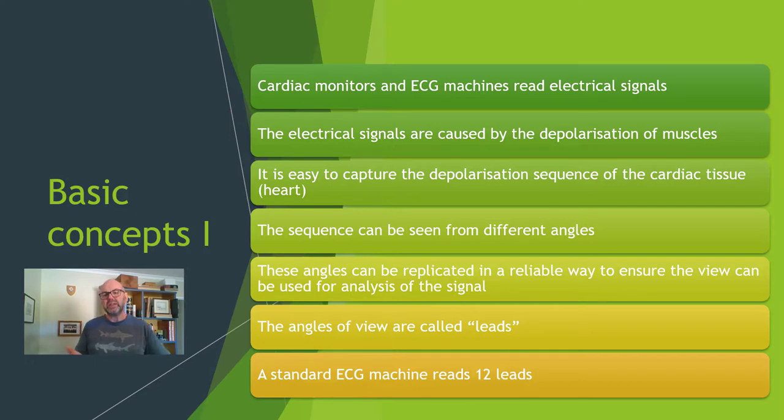You might want to liken this to photographing a car from various angles to sell it on Trade Me or something. The front might appear different from the back of the car, but if it's a good day, it'll still be the same car. Careful placement of the electrodes will ensure that the various angles of view provide some degree of consistency from patient to patient. And from the clinician's perspective, this allows for some reliability in interpretation of the waveform.